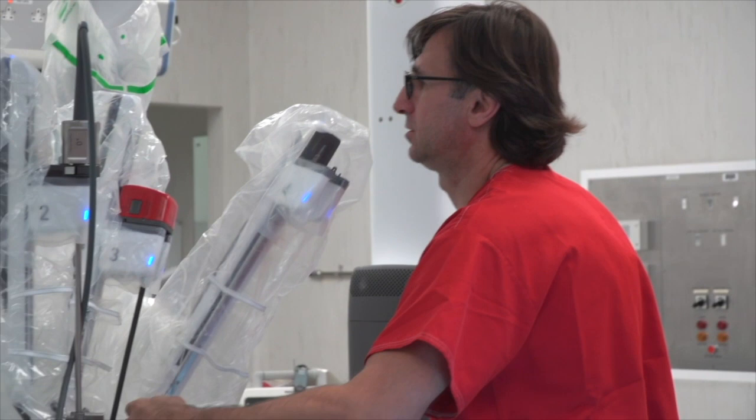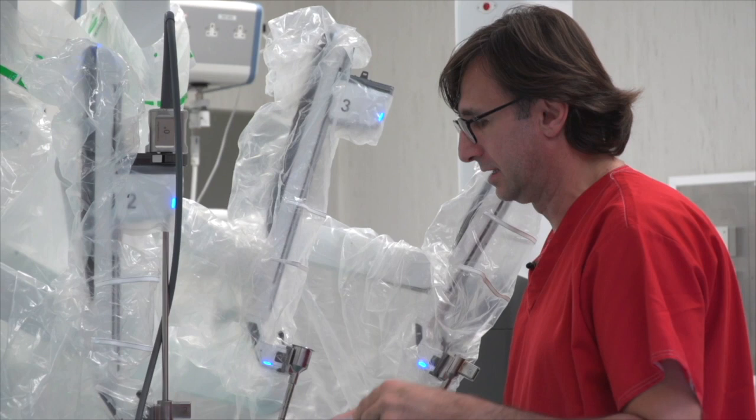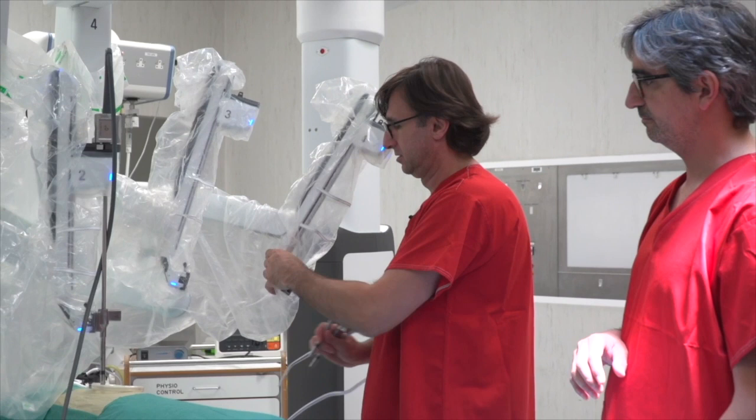So this is how we set up the robot. This is how we put the arms. It's a very quick docking, as you will see. Yeah, this is another thing: 1-2 minutes, and also undocking is very, very fast. For example, you want to undock? You undock this one out, you put this one aside, this one out, this one out. And you are undocked, ready to take action if you have a problem inside, okay? Fast. Changing the ports, moving the robot, it's easy.